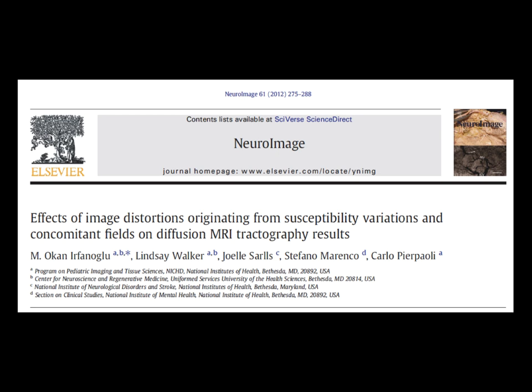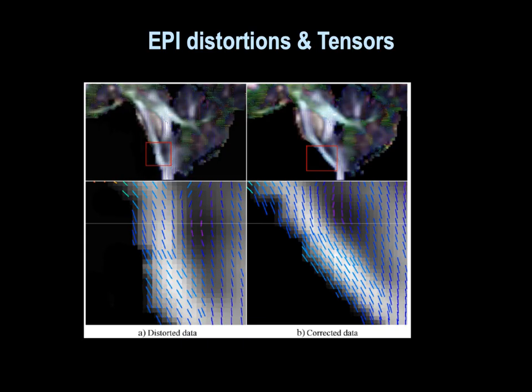this actually is more on the correction, is to show that even in conventional, even if you do not do morphometry, the community for a long time has sort of ignored these distortions in the diffusion-weighted images, because they say, okay, they affect all the DWIs the same way, so essentially we compute our tensor fine on a voxel-wise basis. But if you look at the results that you can have just for doing tractography, this is actually quite compelling.